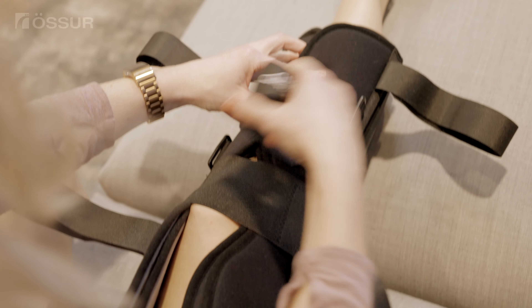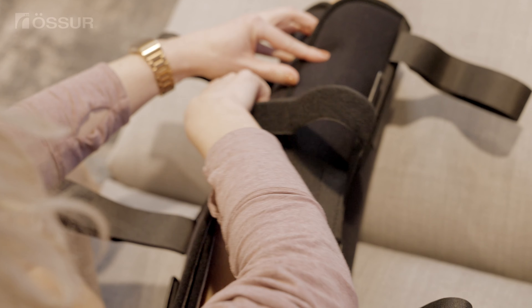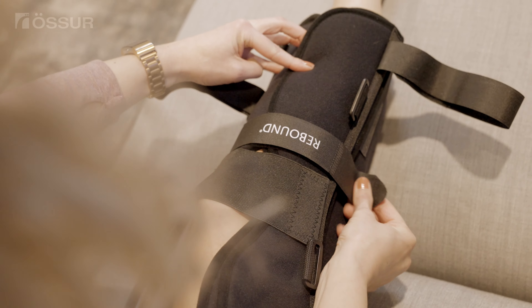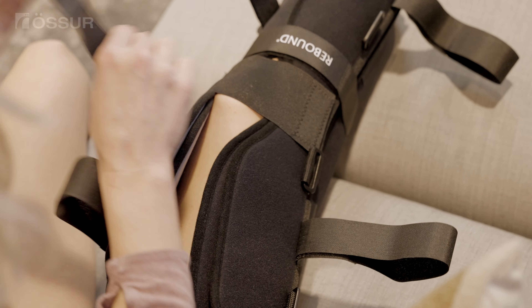Starting below the knee, pull the strap through the D-ring and secure with the hook tabs provided. Fasten in an alternating below and above fashion until all the straps are secure.